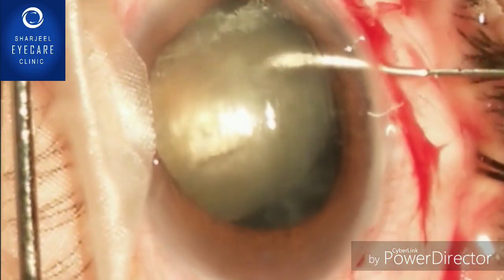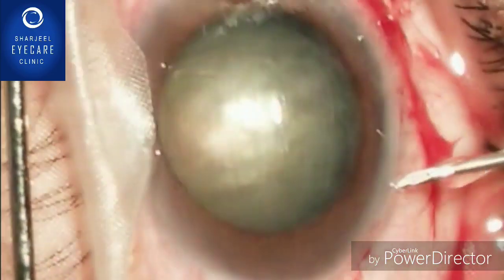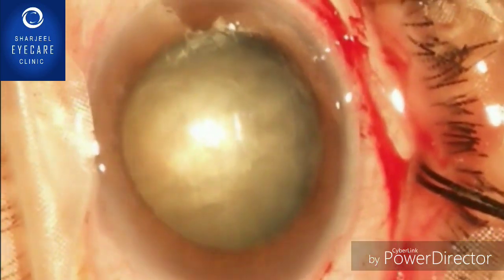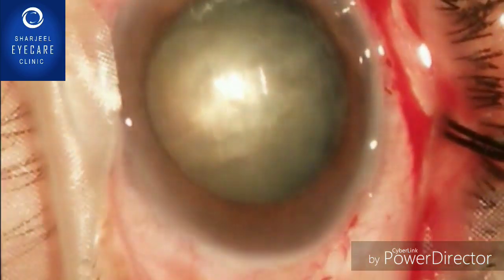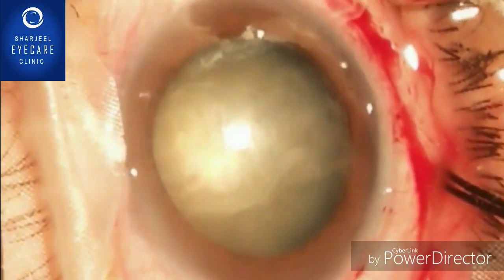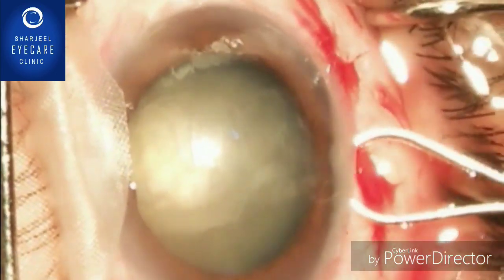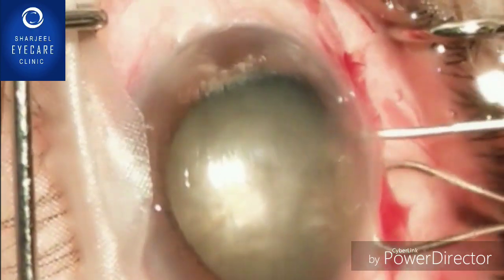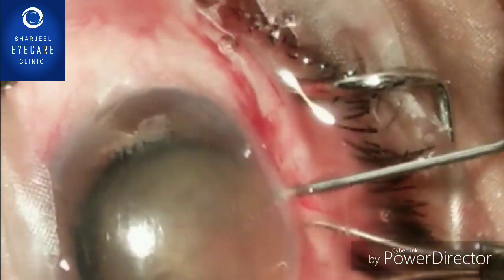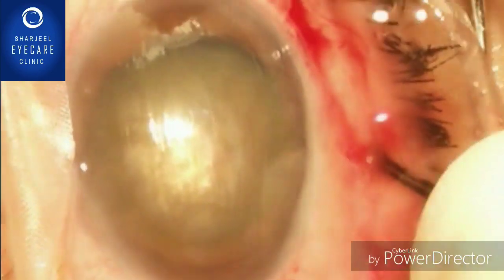Now with the cystotome we are moving the nucleus out of the capsule into the anterior chamber. The nucleus is now out of the capsular bag and into the anterior chamber. With the help of wire vectis, by putting pressure at 12 o'clock with the help of the cystotome, we are slowly and gradually expressing the nucleus, trying our best not to exert too much pressure on the capsular bag.